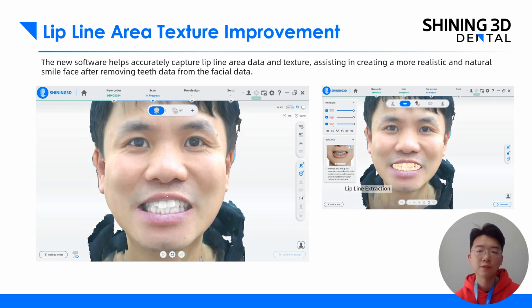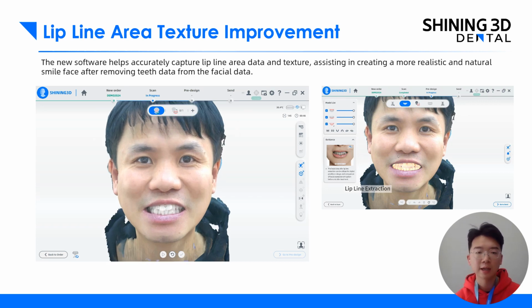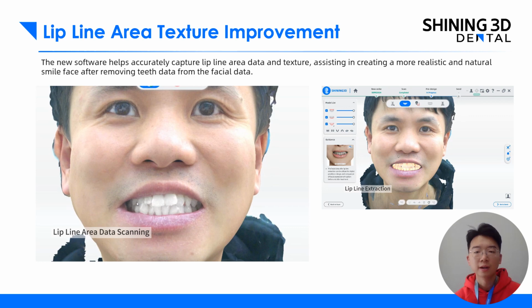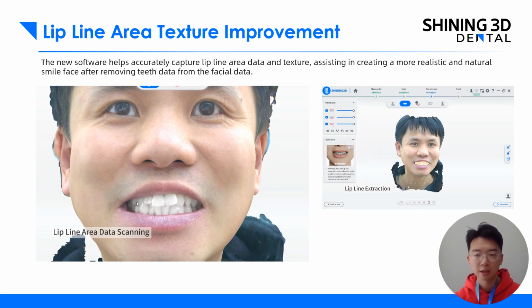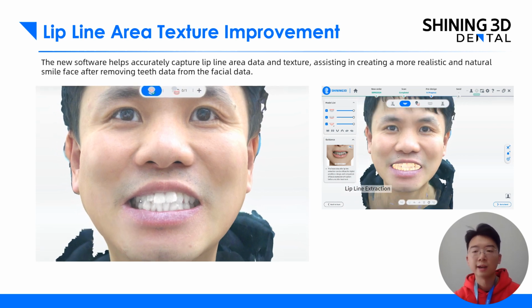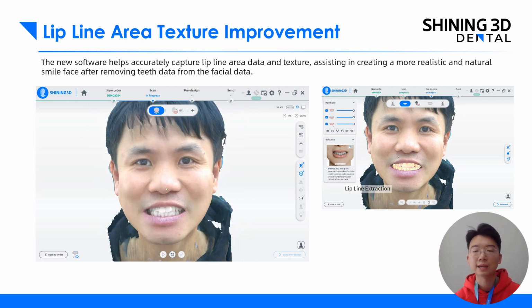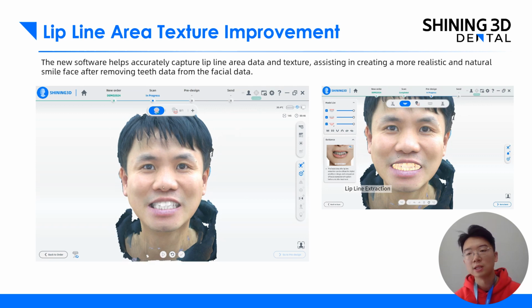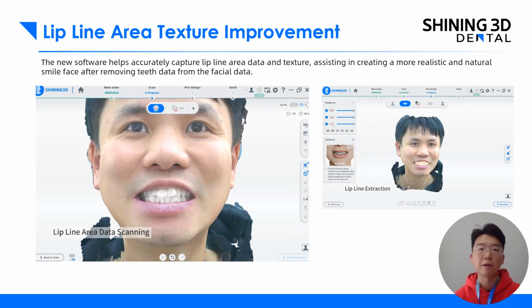As you can see from the video we listed down below, when we are doing scanning, the new software improved the scan results where the upper lip meets with the upper teeth. So this line is more clear compared to the old version. And if we are doing a lip line extraction, we need a clear line for us to do the extraction. So this also helps with other functions used in our new software.